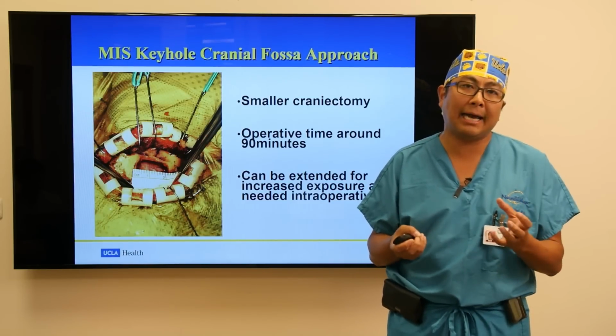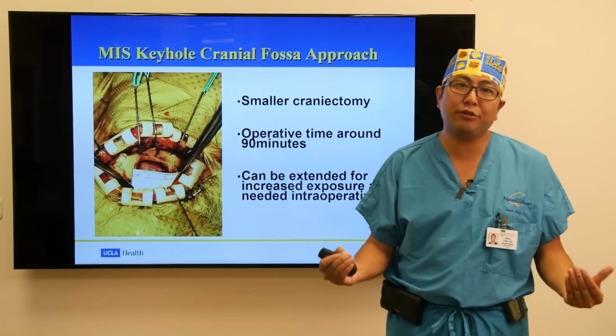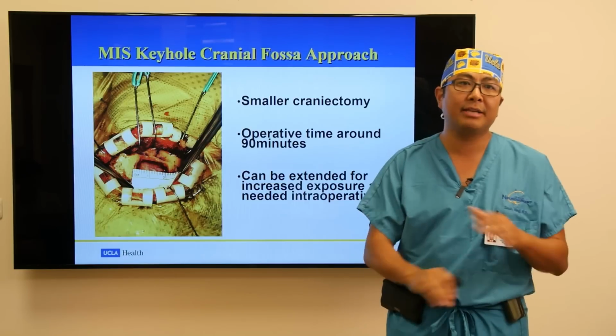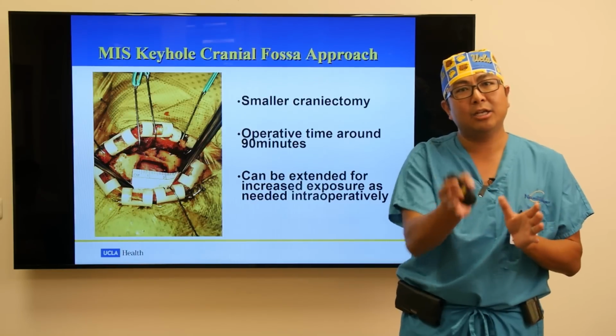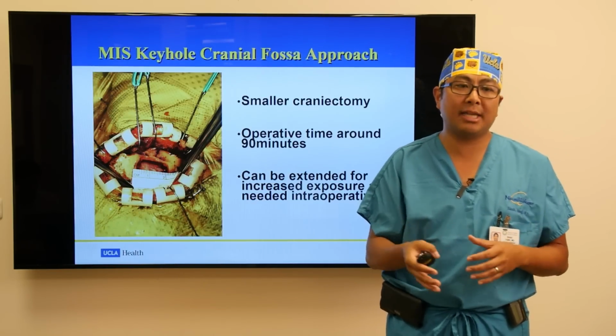craniectomy every time. We start off with that approach, but our backup plan, if the technology fails, the virtual reality fails, the BrainLab navigation fails, the anatomy fails, everything is just going wrong, is that we're then going to extend this into the normal mini middle fossa craniotomy, the 2 by 3 centimeter approach.